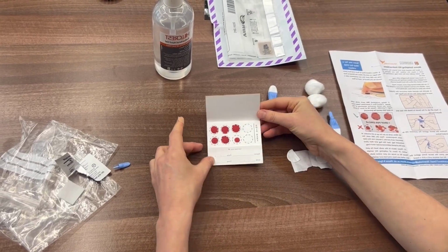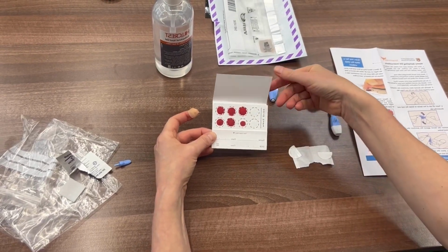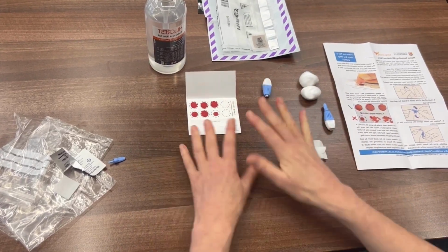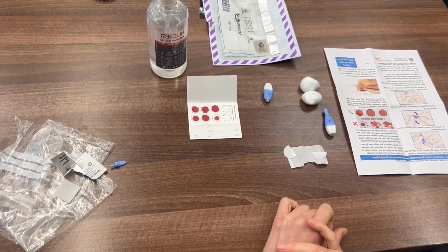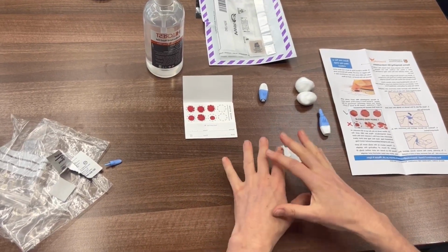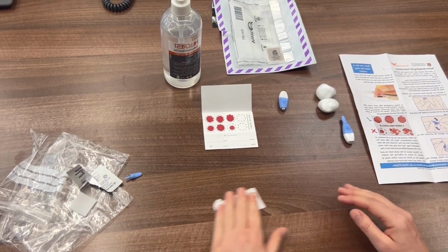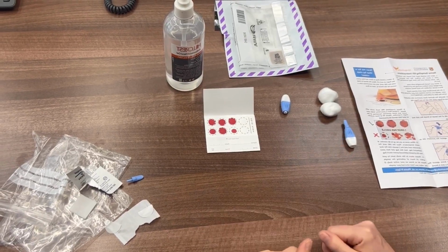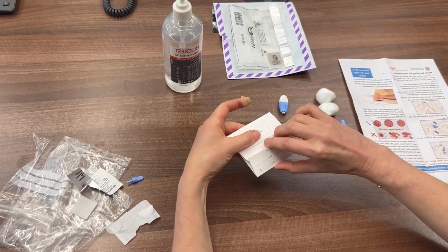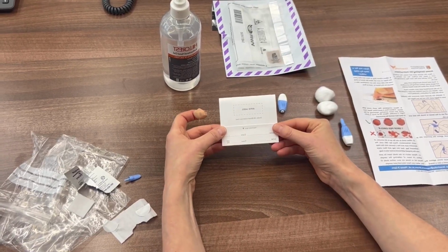So we've then got our dry blood spot card. Remember, I would like you to complete all of that card, but just for the sake of time, I've not done that today. What I then do is put this aside for about half an hour. And what that does is it allows the blood spots to dry into the card. So when it is in the card, it's completely safe like that, unless it gets wet. So let's assume I've let that dry for half an hour. I then tuck underneath there, it says tuck cover here, and your label will be on there.